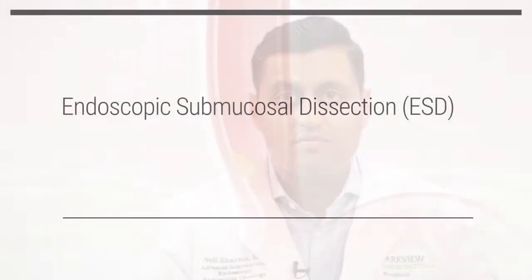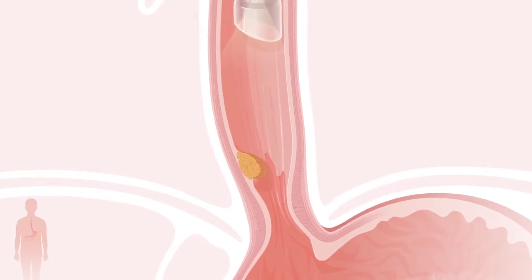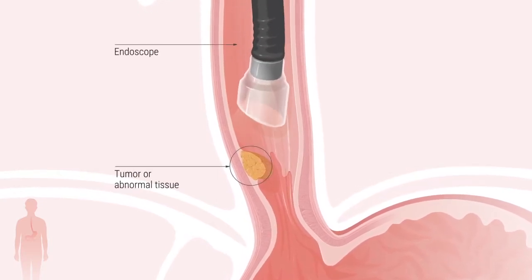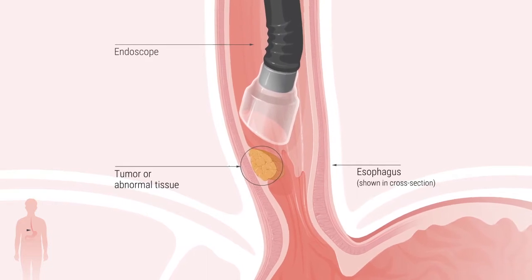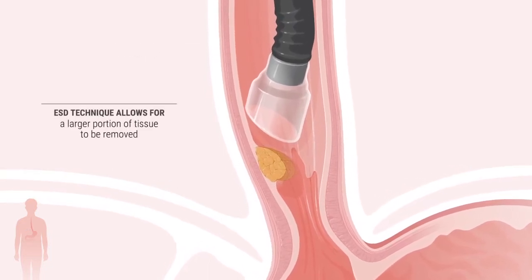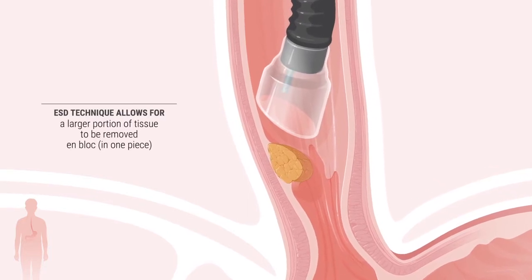In the following animation, we describe a technique for the resection or removal of abnormal tissue through the endoscope. Endoscopic submucosal dissection is a complex procedure where a doctor uses an endoscope to remove a tumor or other abnormal tissue in the lower esophagus. This technique allows for a larger portion of tissue to be removed en bloc, or in one piece.